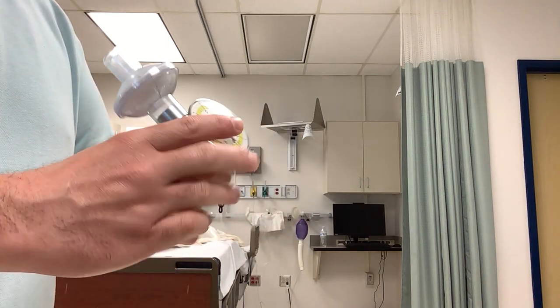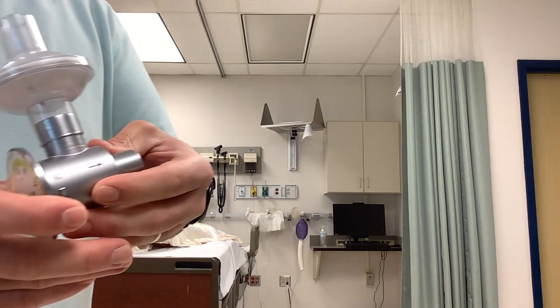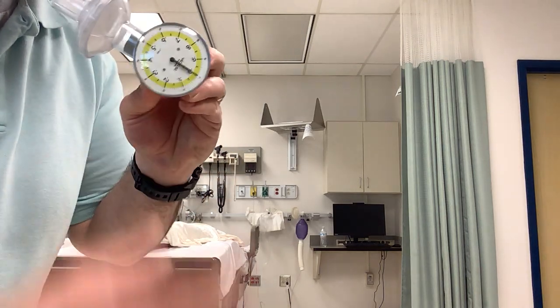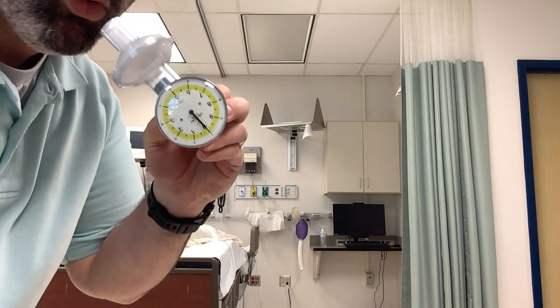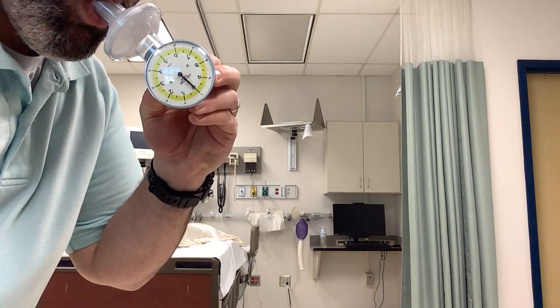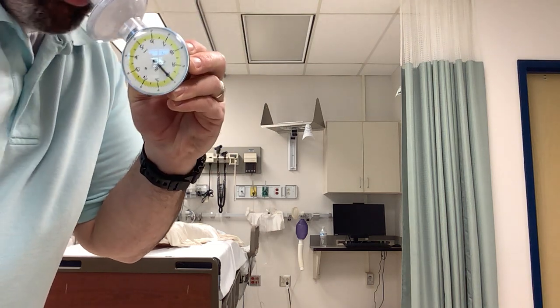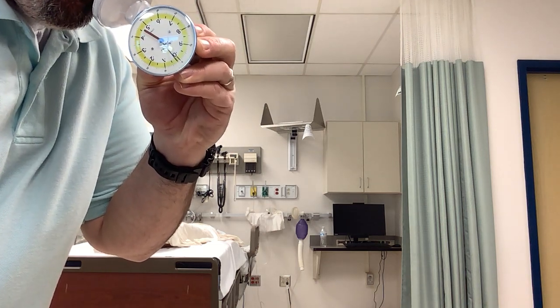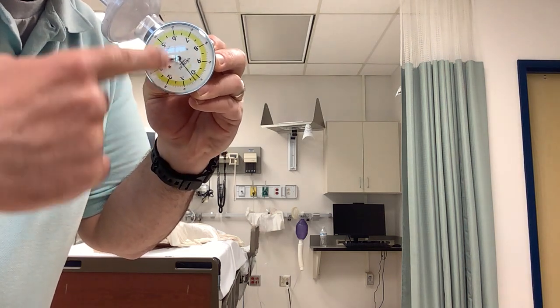So if I were to have this slid in the off position, you will not have any change in volume. It will not capture any volume coming through. You can see that. Slide it to the on position, and then it captures. Notice the smaller needle makes a complete revolution.